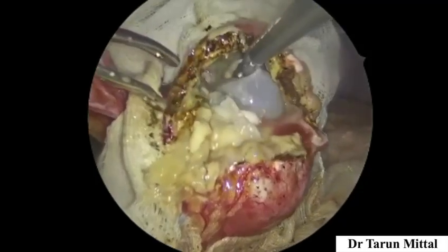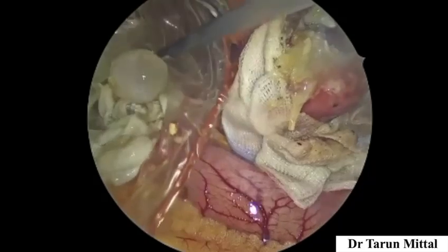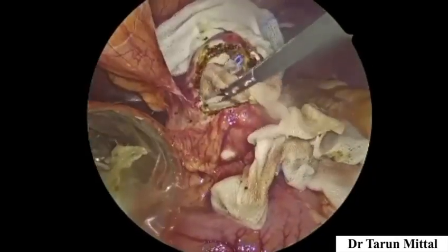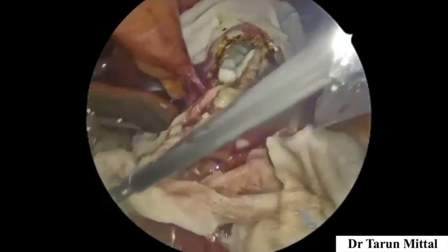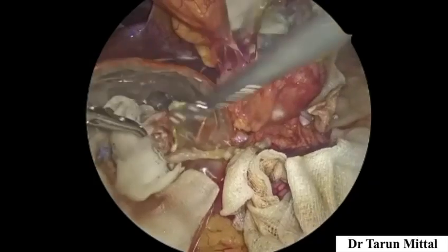This is the germinal membrane which we can see. These are the daughter cysts, and sometimes there can be brood capsules and scolices as well. We have to be patient and keep on removing the germinal membrane and the scolices, and we have to do a partial cystopericystectomy.